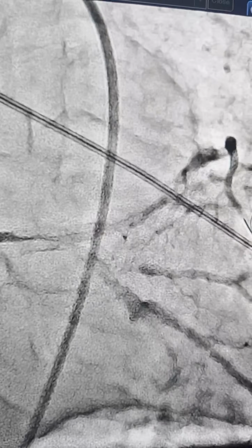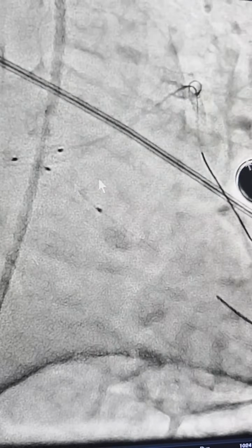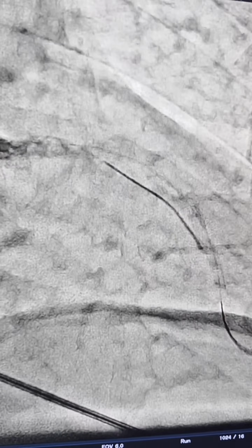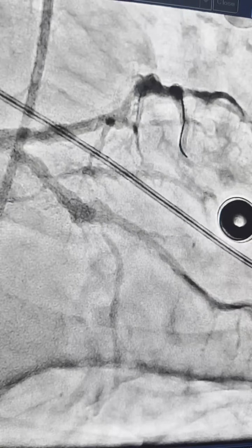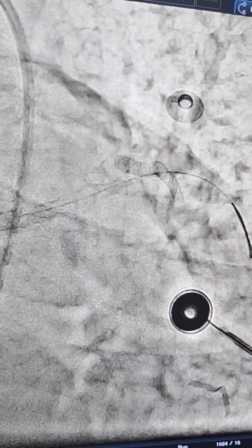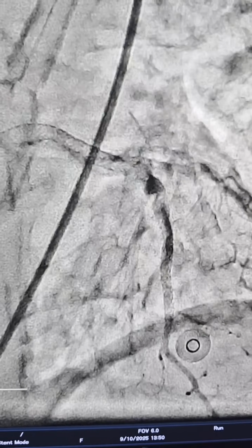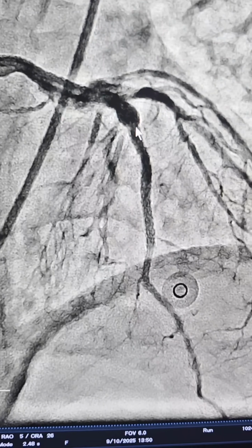In any case, we had intubated and sedated him, and then wanted to open the start of this, so we did a kissing, final POT, and I decided I'm not going to leave anything to chance, so all the NCs. This looked a little bit narrowed here, so we put in another stent on top of that, and so we had now stented all the way into the proximal LAD. I did the NC, and this was the final shot, the final cine, and you can see that this looks okay now.